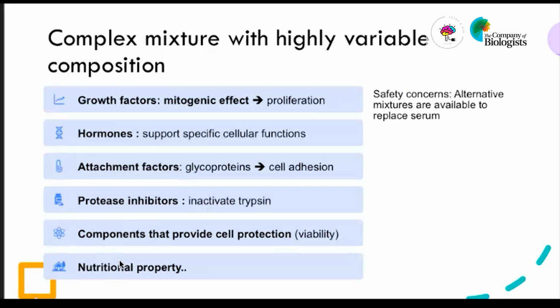Serum also provides basic nutrients and other compounds that provide cell protection. However, serum can have safety issues, so there are alternative mixtures available to replace it.